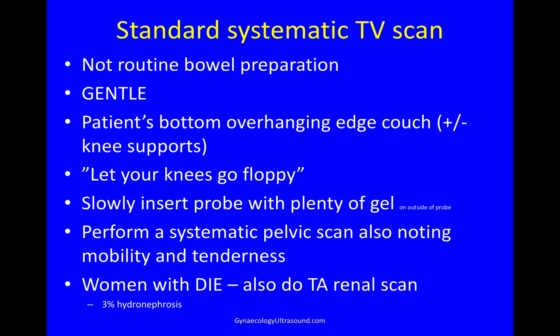When I do a systematic transvaginal scan of the pelvis, I don't routinely ask the patients to have a bowel preparation. The main thing is to be really gentle and to have the patient positioned well, so that the patient's bottom overhangs the edge of the couch a little bit and either has knee supports or a chair for the feet. And then I always say, let your knees go floppy, as this really relaxes the legs and the pelvic floor. Then I slowly insert the transvaginal probe with plenty of gel on the outside of the probe and perform a normal systematic pelvic scan, looking also at mobility and tenderness.